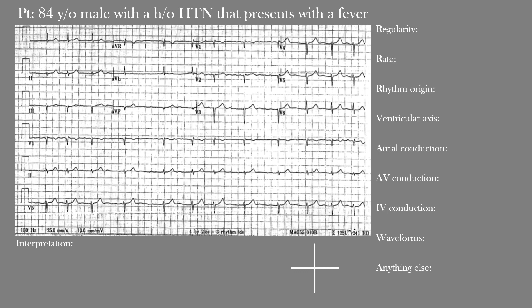Our 84-year-old male with a history of hypertension presents with a fever and this EKG. First off, what is the regularity of this rhythm? On first impression, you probably notice that the rhythm appears irregular — not only irregular, but irregularly irregular. Let's look at why that is.